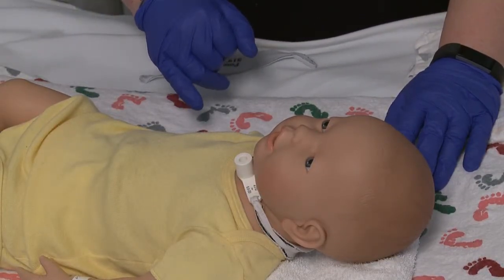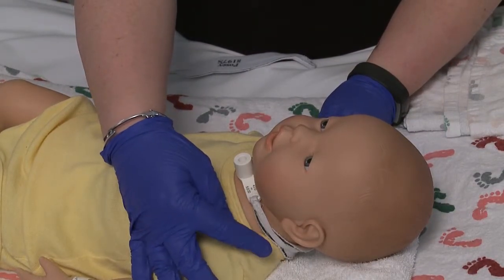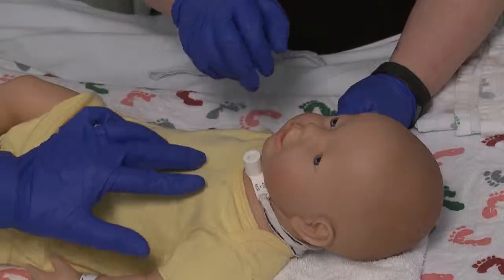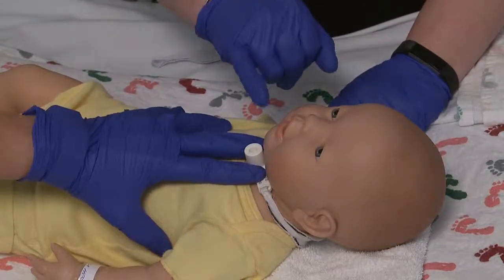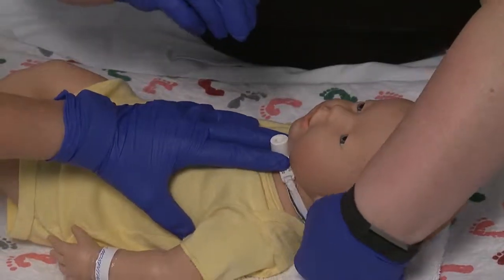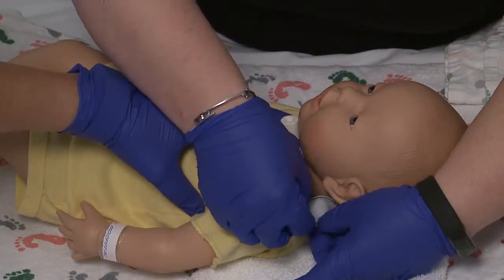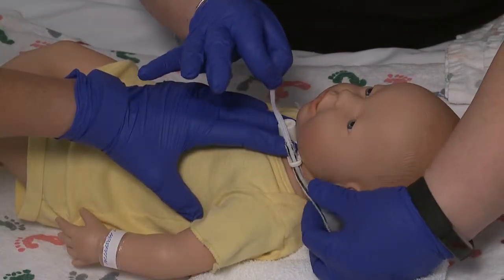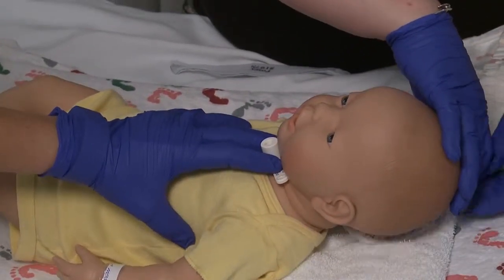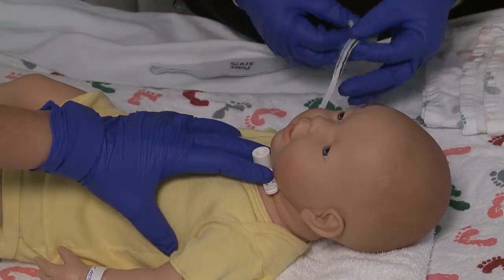When cleaning your tracheostomy, you always want to assess the trach tie for any dirtiness or wetness and change that out as needed. When changing a trach tie out, you always need a second pair of hands to keep the trach secure and stable during this process. You would un-velcro the tie on one side and pull it out from the eyelet on the tracheostomy flange. Lift your child's head up, pull that tie out, un-velcro from the other side and pull that tie away.